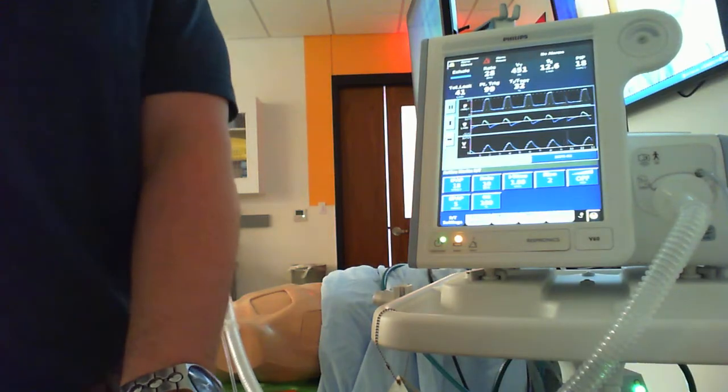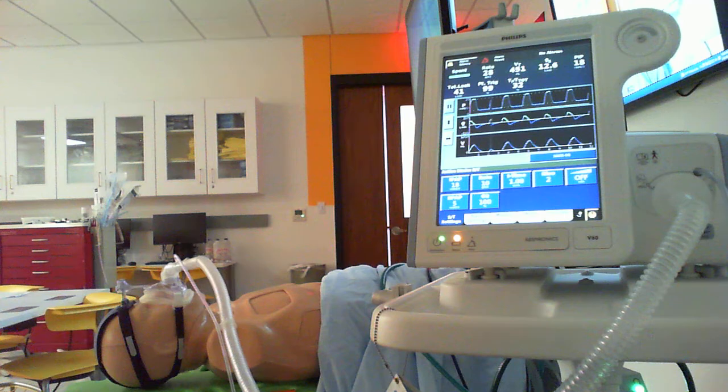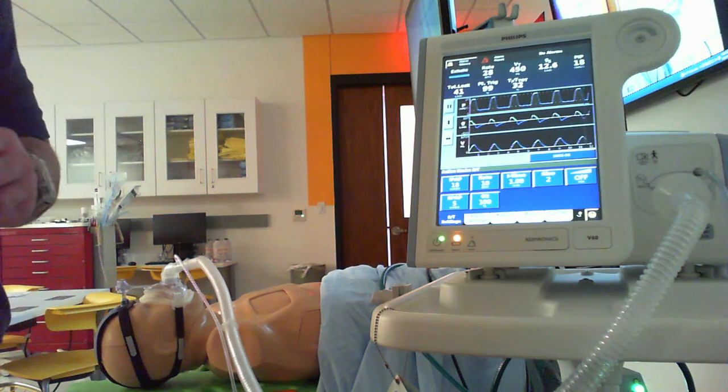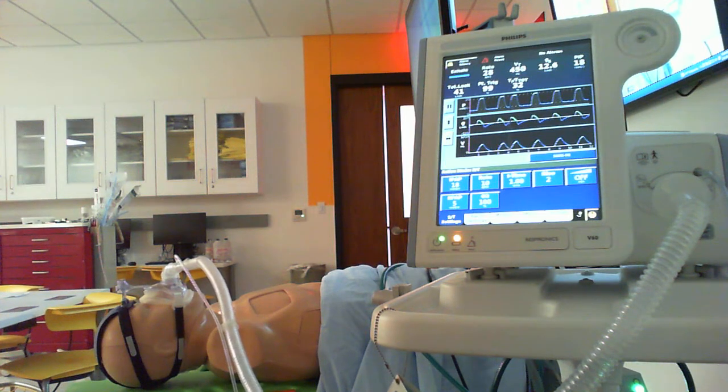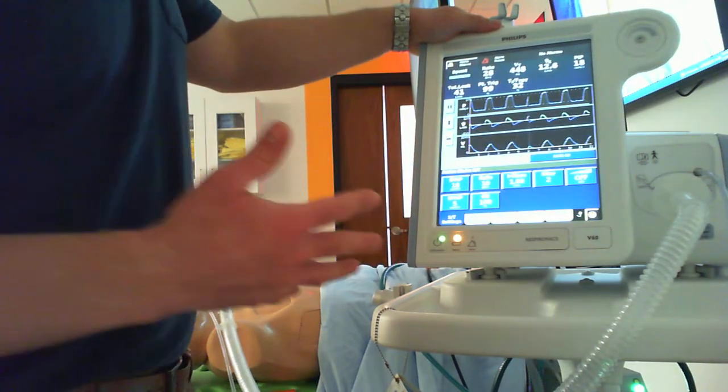I really like transcutaneous CO2 monitoring for initiation of non-invasive ventilation. Capnography, not that we couldn't put nasal cannula on this guy to measure CO2 or something like that. But there's so much base flow. I don't necessarily trust those values that we're getting for a lot of our patients. Transcutaneous is a very good option for these patients if your facility has this. Okay, a lot of places maybe only are using those if you have more of a pediatric population, but it's very valuable in adults. Okay, so we need to make sure we're monitoring them.